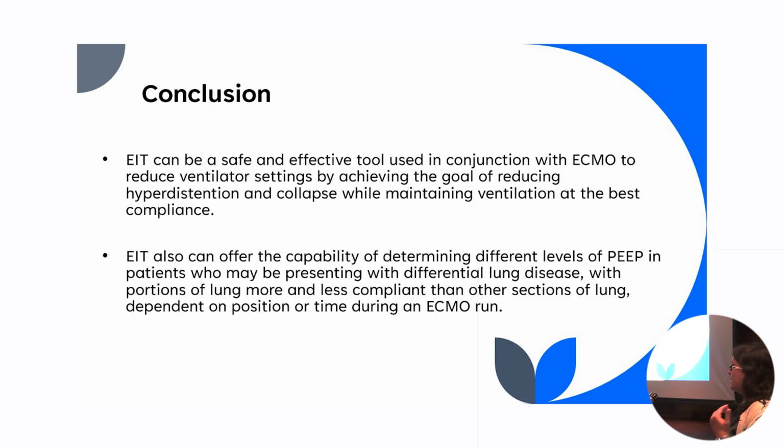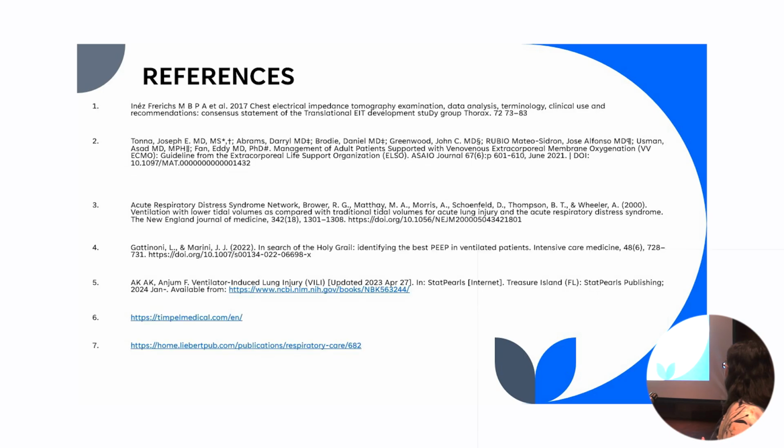In conclusion, EIT can be a safe and effective tool used in conjunction with ECMO to help reduce those ventilator settings while maintaining our best ventilation and compliance. And it also can offer the capability of determining different PEEP levels for patients who can present with different lung disease. These are my references.